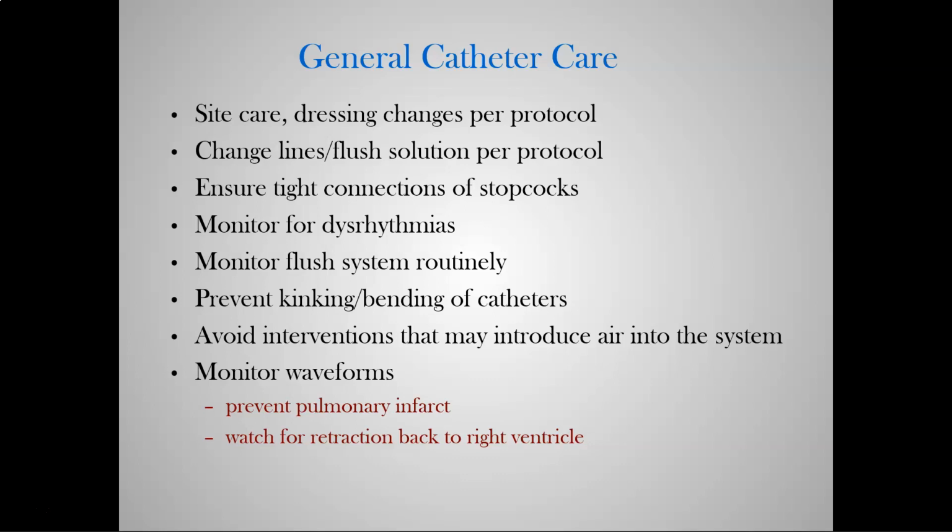Monitor for dysrhythmias whenever you're manipulating any of these lines. During the insertion of a central line, absolutely. During the insertion of an arterial line, not even closely as common, but it is possible, technically. During Swan-Ganz insertion, absolutely. During any central line, you're probably going to be on some kind of cardiac monitoring for the duration of the procedure. Now, the Swan-Ganz, you absolutely will be on ECG monitoring.